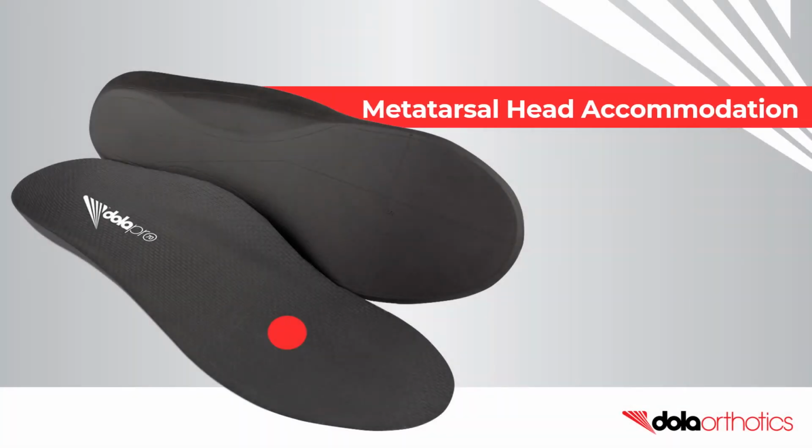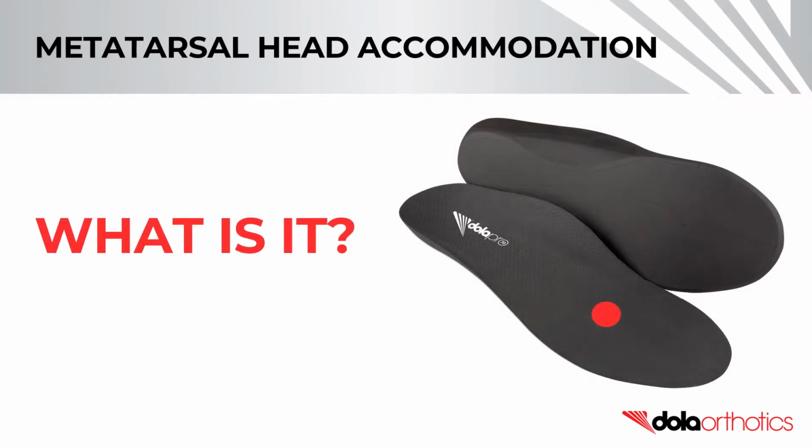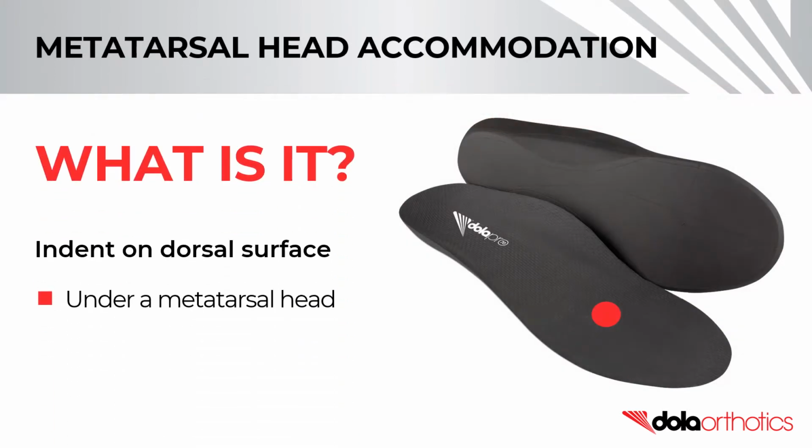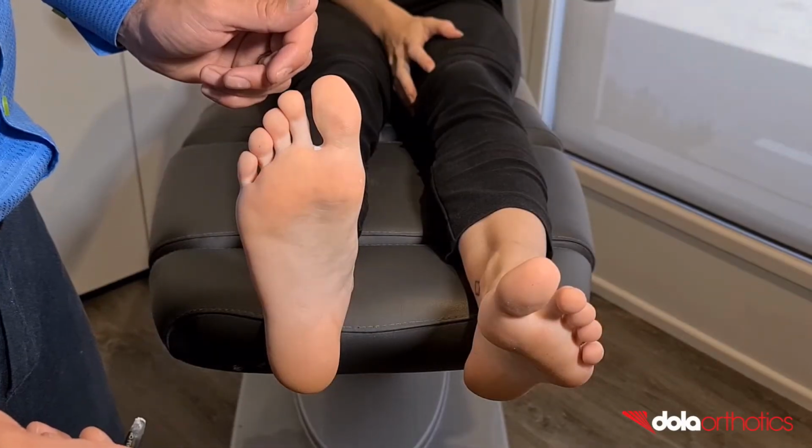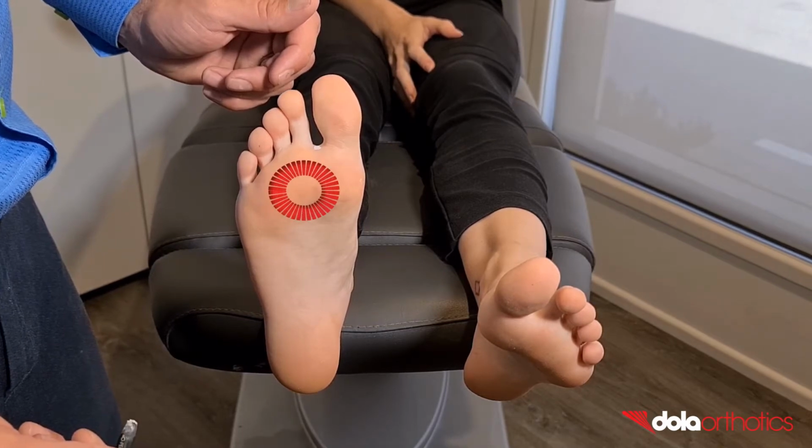How to customize your DOLA Pro with a metatarsal head accommodation. A metatarsal head accommodation is a partial thickness indent on the dorsal surface of the orthotic under a metatarsal head. In this video, we will show you how to complete a metatarsal head accommodation in clinic.